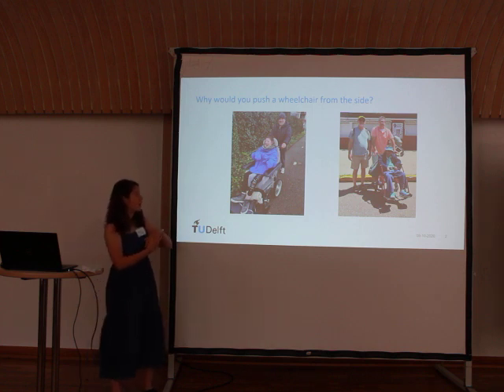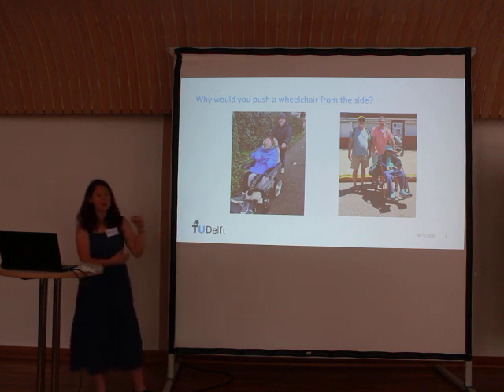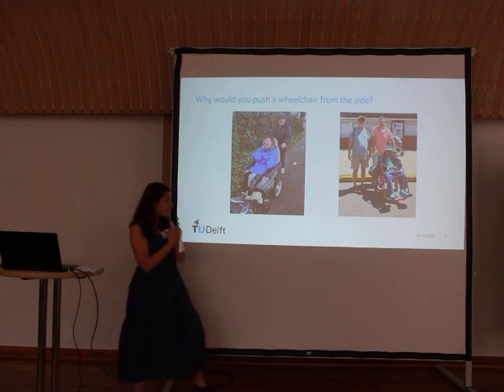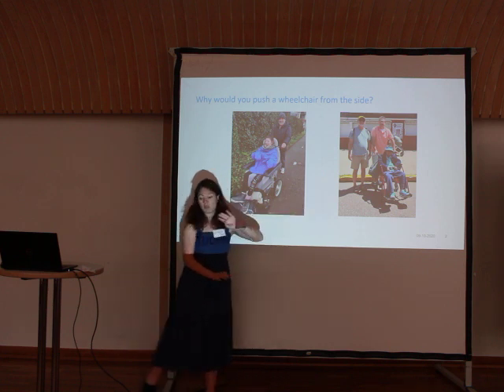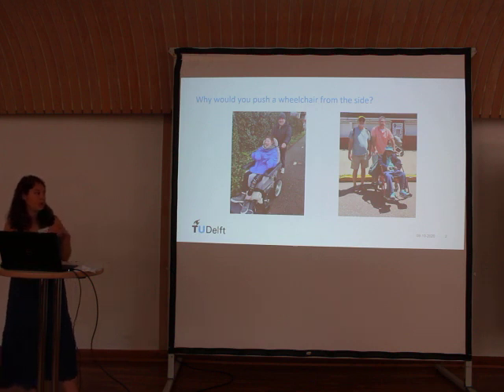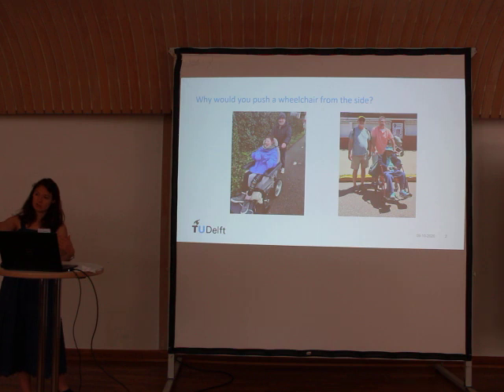The first is actually the reason that this wheelchair was designed. Children with profound intellectual and mental disabilities who have difficulty with verbal communication, and so having that body language is really helpful. And it's also useful for people with dementia. So I'll talk more about this later, but this design is being put onto a device that is going into different care homes so that people with dementia always have visual sight of their caregiver, so that if there are any memory losses, they do always know that that person is working with them.